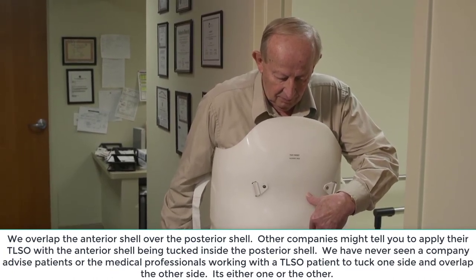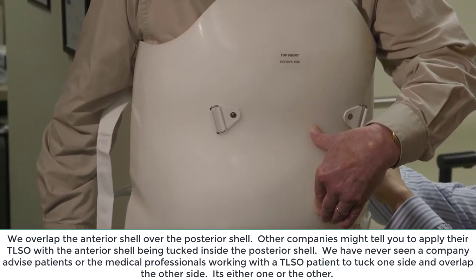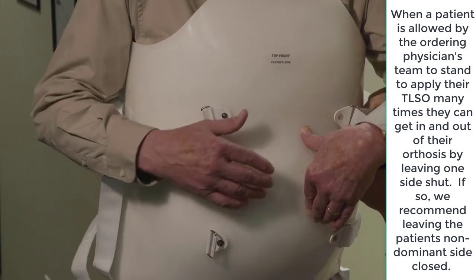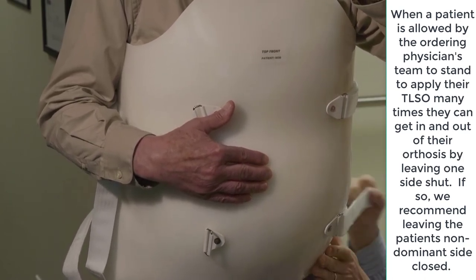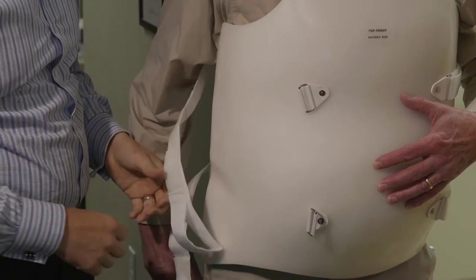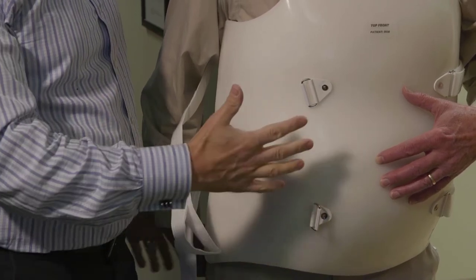It's meant to feel like it's giving you a hug, so you're going to feel that now. Now I'm going to show you how we tighten this up. This is us approaching the brace in the standing position, and we're going to make more points as we go.